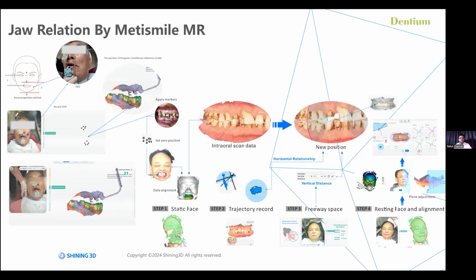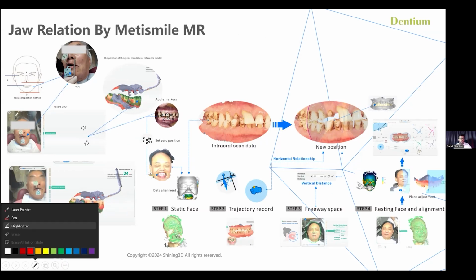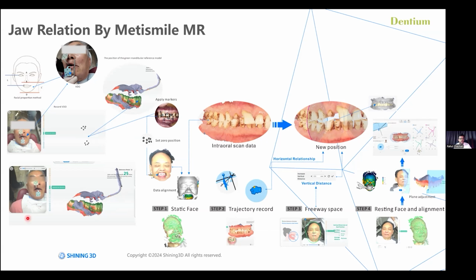See, this kind of movement you need to capture in the patient's mouth, then you will get this kind of graph here. You can see this is the most repeatable horizontal point of the patient's mouth when the patient is moving, opening and closing this way.